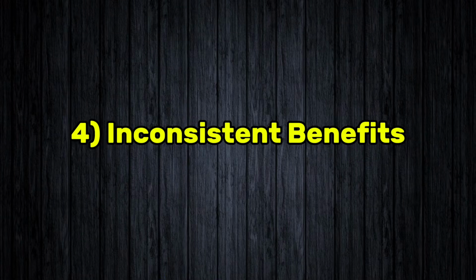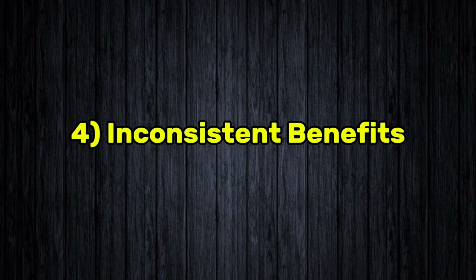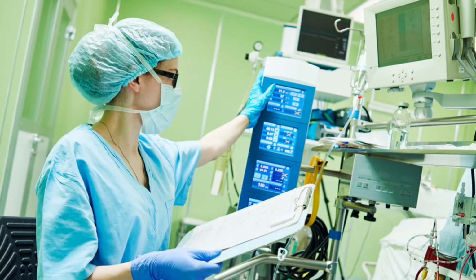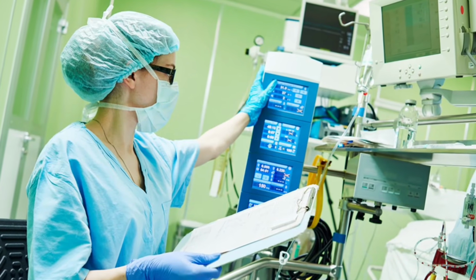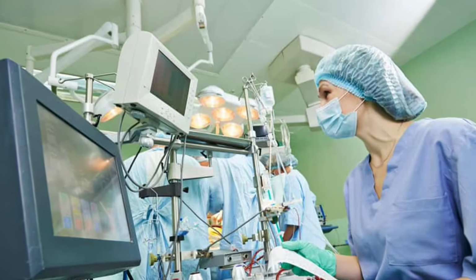Fourth is inconsistent benefits. Not all studies agree on the advantages. In some cases, outcomes are not significantly different compared to non-pulsatile perfusion. So as a perfusionist, deciding whether to use pulsatile perfusion is a very practical question to address. So we will see in which patient pulsatile perfusion is recommended.